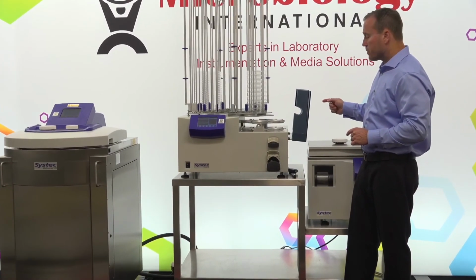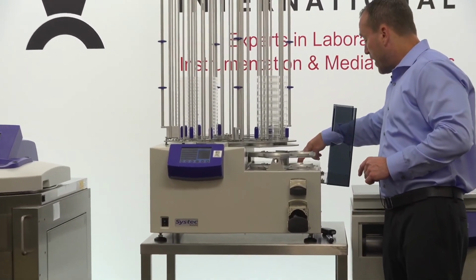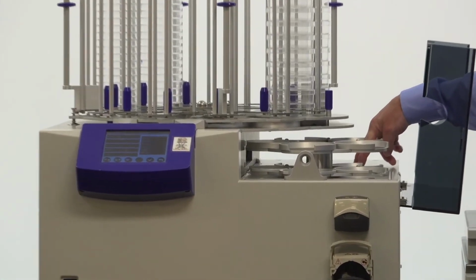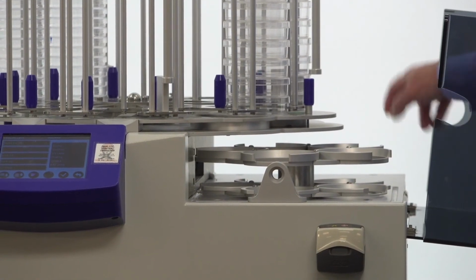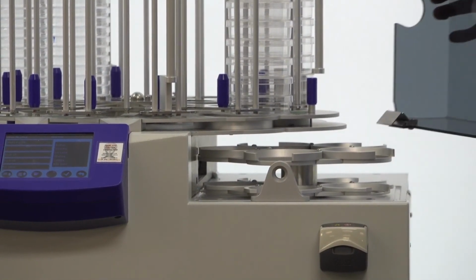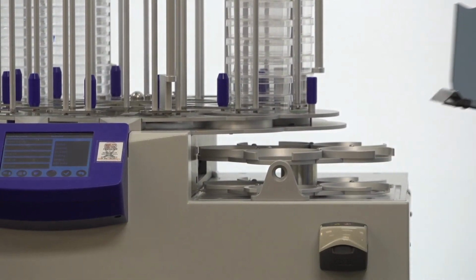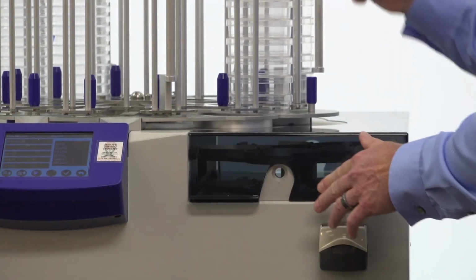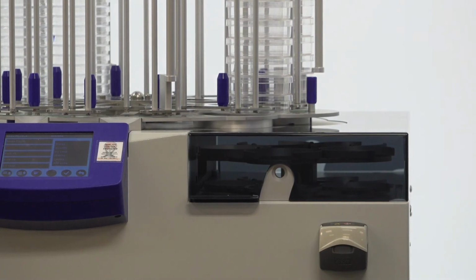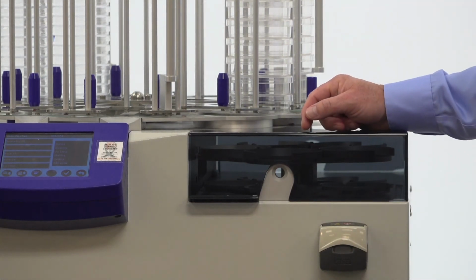So on this instrument, in the back, located here, there is the ability to put a print head directly in this area. It would load through the back of this lid, so you'll see a hole in the back of the lid as well. So the print head comes directly through there, and then it will dispense directly on the side of the plates as they're being filled. The printer that we offer is a Lynx printer.